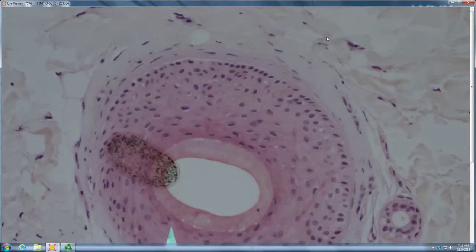So for alopecia, sometimes you look for intersecting lists of differential, right? Here you got miniaturization, that could be pattern or could be AA. Don't see pigment, don't see eos, don't see inflammatory cells, but do have some catagen hairs. So would still keep both of those in my differential. Okay.